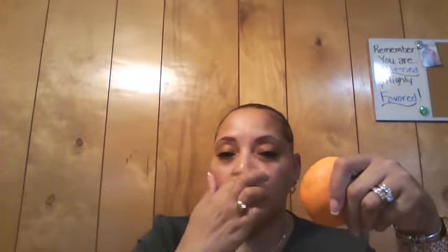Recap this with the needle attached. And now I'm going to let him know that I'm going to grab the back of his arm or the side of his arm, and I'm going to squeeze it, get a firm grip on it with my non-dominant hand. I'm going to scrub from the inside outwards in a circular motion. I'm going to allow that to dry for 15 to 30 seconds.